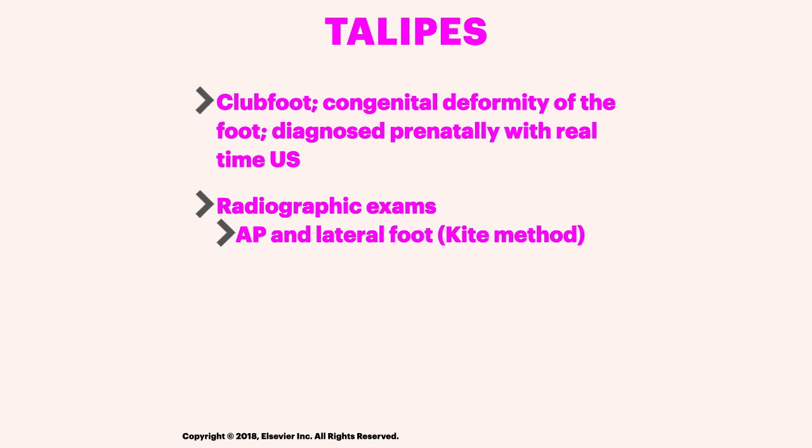Talipes, I think is how it's pronounced. Otherwise known as club foot, congenital deformity of the foot, diagnosed prenatally with real-time ultrasound. Radiographic exams, AP and lateral foot, the Kite method.